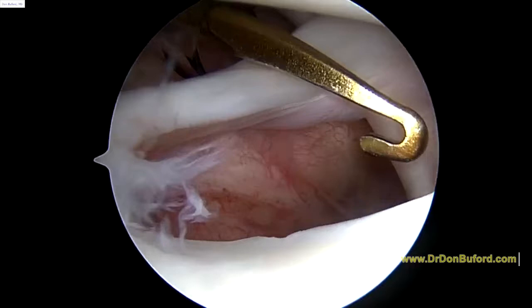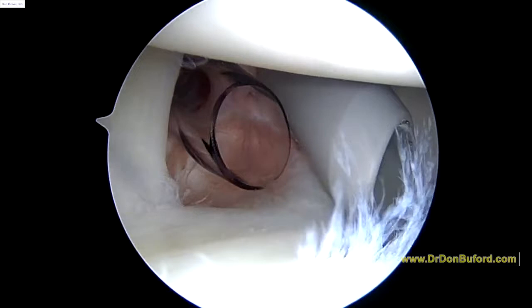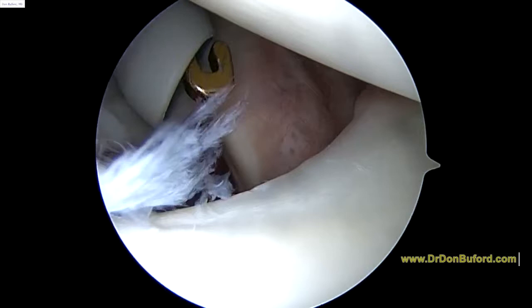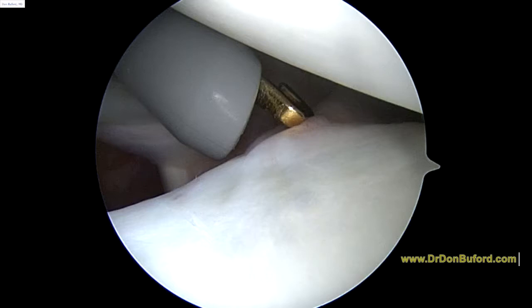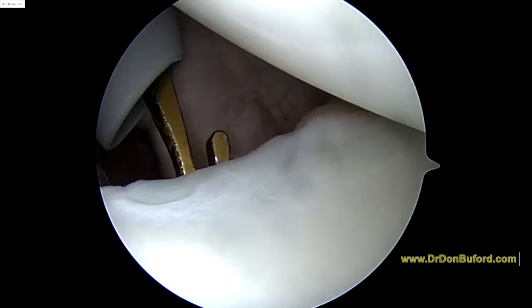A little bit more anatomy. This is the subscap tendon here. If I hold down on the middle glenohumeral ligament, you can see the subscap going up to the right. Your shoulder was very unstable in the posterior direction, which is what we felt was happening in the office as well. This is the anterior band of the inferior glenohumeral ligament right here — this little fold right here — that's the anterior band of the IGL. The labrum here is fine in the front.